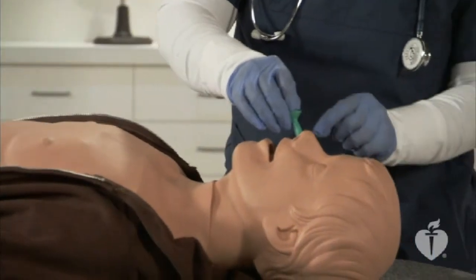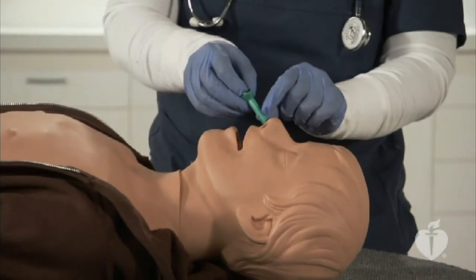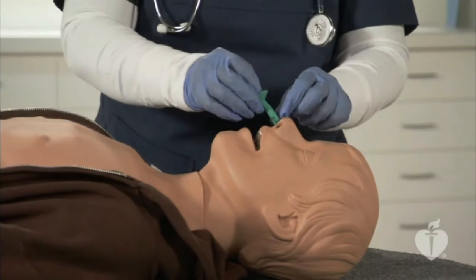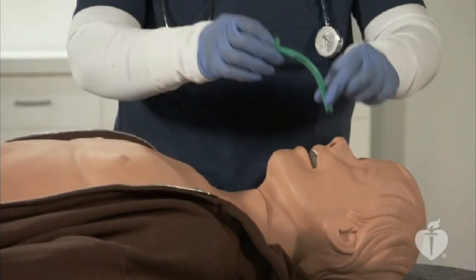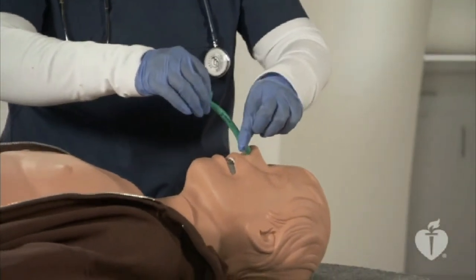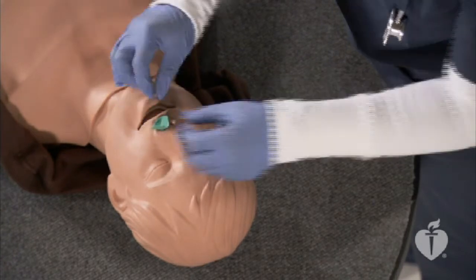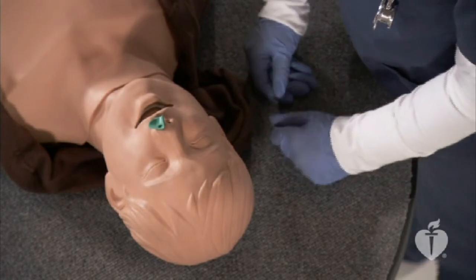If you feel an obstruction during insertion, gently withdraw the airway a centimeter or so, rotate it, and gently try to insert it again. If you continue to encounter resistance, withdraw the airway completely. You may try inserting it in the other nostril. Use caution when inserting the NPA in patients with severe head trauma. With a known basal skull fracture, an oral airway is preferred. The NPA can be inserted in patients who are awake or who have a cough or gag reflex.